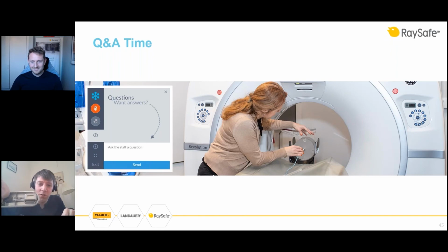It's only open at the top, and anything that comes from below is shielded. That radiation will not be picked up by the RF sensor, while the X2 CT sensor, being an ion chamber, will see radiation both coming from above, from where your X-ray tube is, and also any kind of backscatter from below or side scatter. And it's also then not really visible on an image, and therefore does not affect AEC.